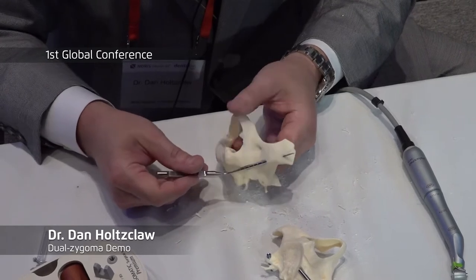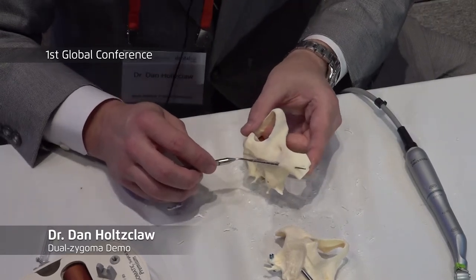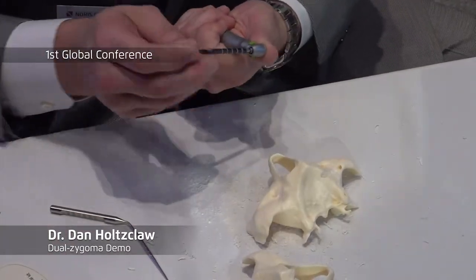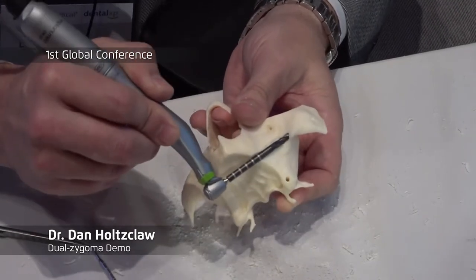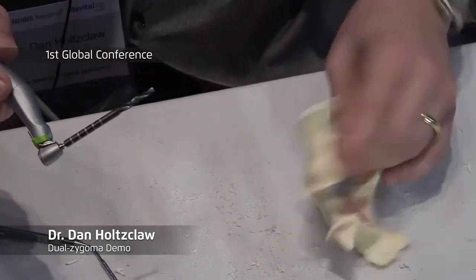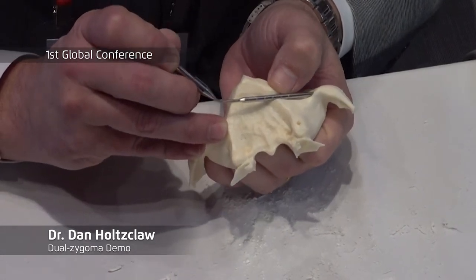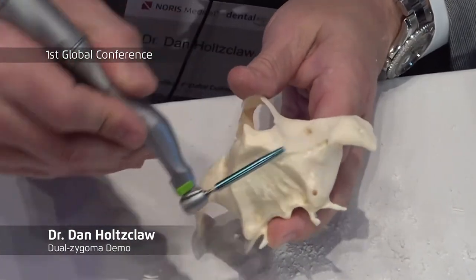Take this measuring device, place it in here — you see how it pops through, so you should feel that on the skin; you'll be able to put your finger on the cheek and feel this. Normally in the mouth we'll just drill up to the number two drill, then the number three drill. The measuring device has a little hook which hooks onto the bone — now you're measuring onto the ridge. If you count one, two, three lines, that's 45 millimeters, and then you subtract two and a half millimeters to account for the abutment in prosthetics.